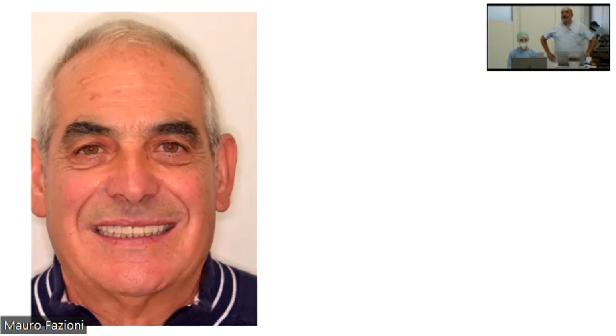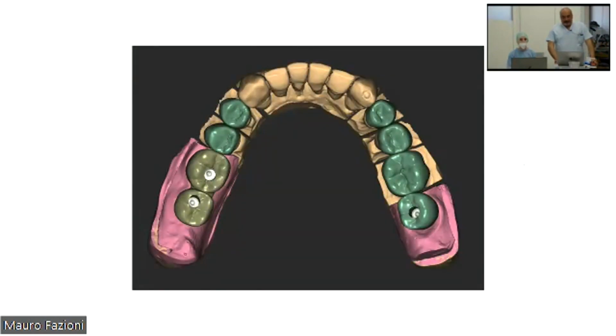This is what's happened to the patient directly after adhesive cementation of the additive bite. After this, after 3 months of chewing with this device, we can go forward doing the final segmentation.